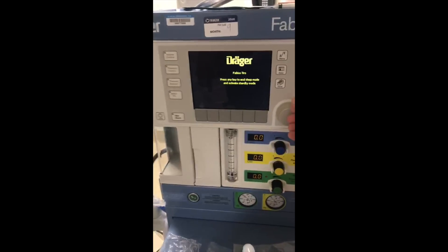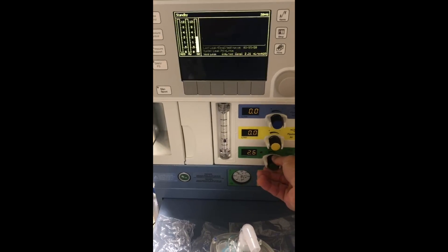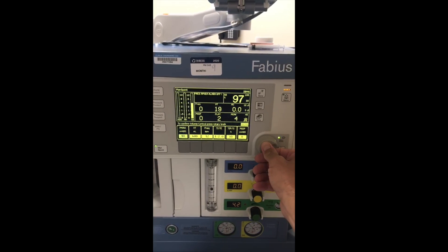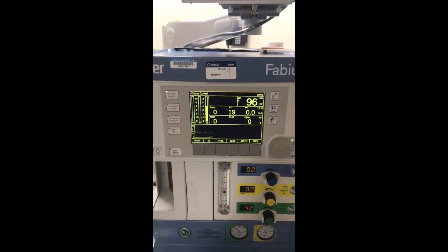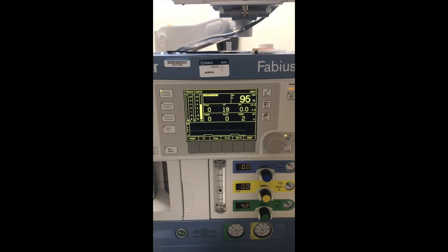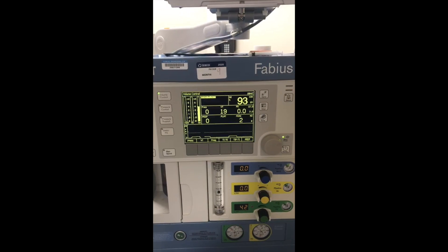We'll turn our trigger on, get our flows up — typical flows — and put some volume control on. Just as an example; we can use any mode, it won't matter. We would check the machine out fully. In the ICU, we won't have any anesthetic gases or anesthetic vapors attached. Letting the system pressurize here.